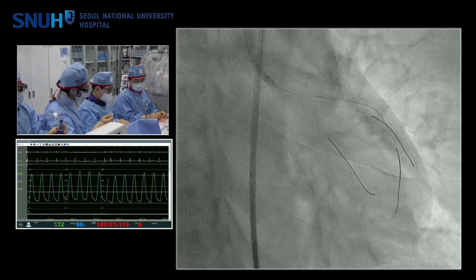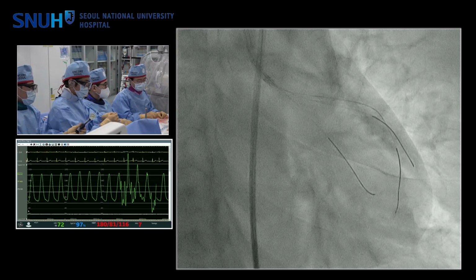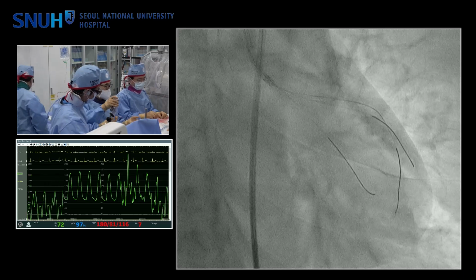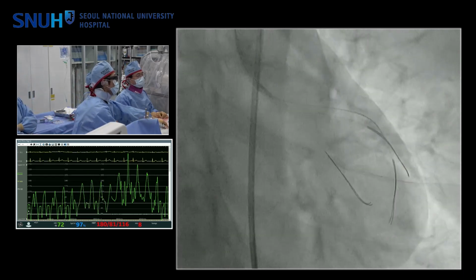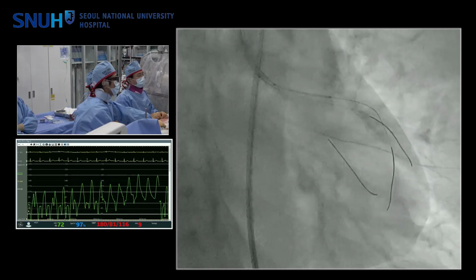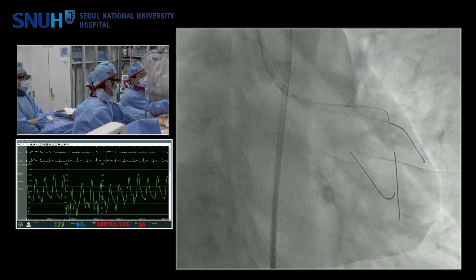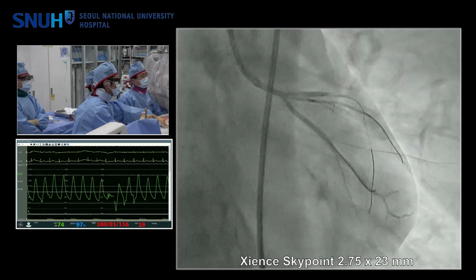I agree with the Zabo technique because it can give me confidence to make sure the stent position is not too deep, and just the outside distance I have decided, maybe one strut, two struts. That makes sense, using that technique.